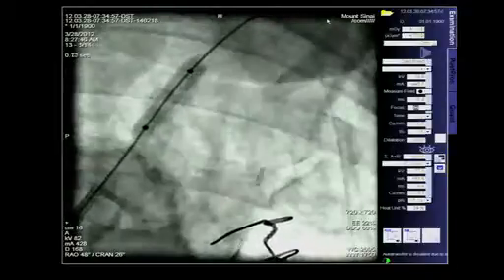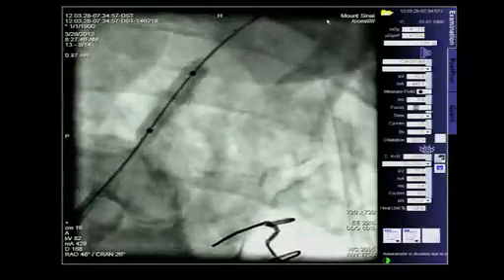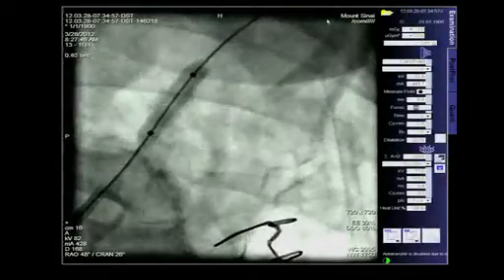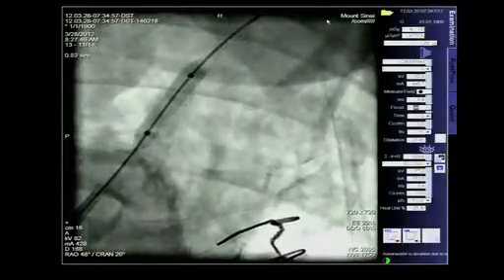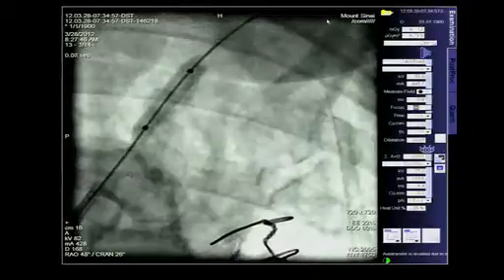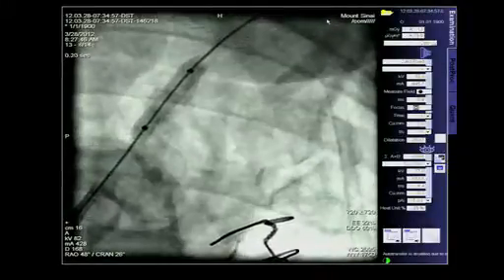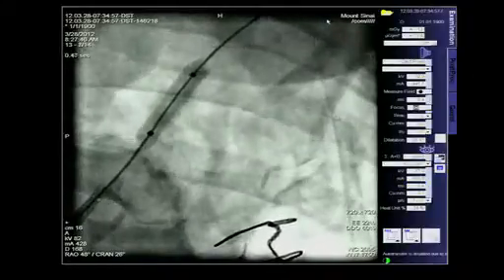I think here, in our experience, an 8 mm stent, I'm going to discuss with Dr. Wiley, obviously, see what he thinks, whether an 8 mm stent or a 7 mm stent, and then we decide. We know that the CT measured it from 7.7 to 7.9. So as we go up with the stent, we can go to profile, see how it looks, and then decide whether we need to go up any further.